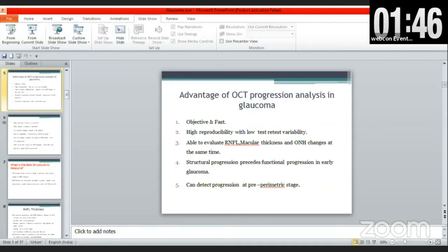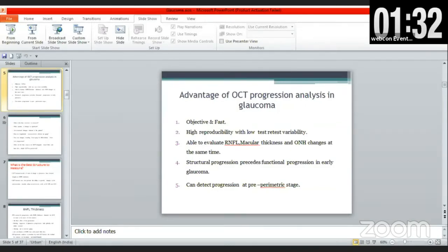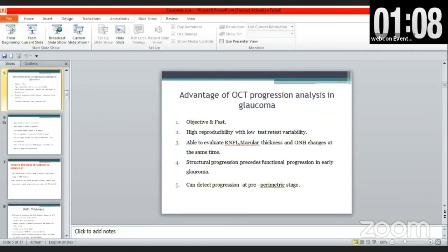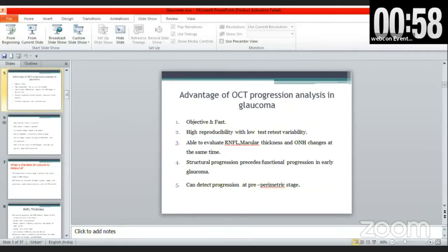There are now available OCT systems for combined structure and function evaluation, known as the FORUM platform, which automatically combines relevant information from the Humphrey Visual Field, Cirrus HD-OCT, and fundus images. The HFA and Cirrus OCT combined report on FORUM summarizes the patient's structure and function analysis on a single printout, based on longitudinal data rather than normative comparisons. The red areas show outside-normal-limit or severe thinning; yellow is borderline and green is normal.